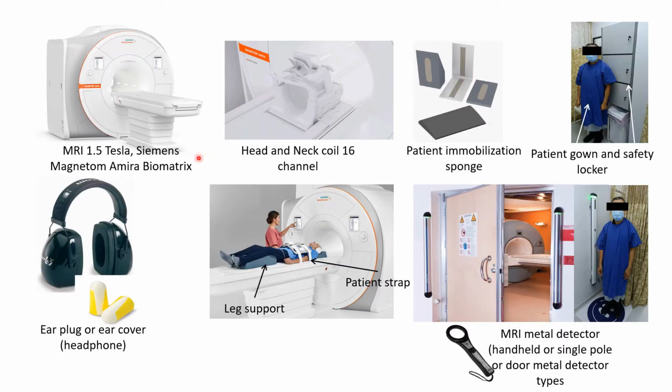In the slide, this is the MRI 1.5 Tesla Siemens Magnetom Amira Biomatrix.